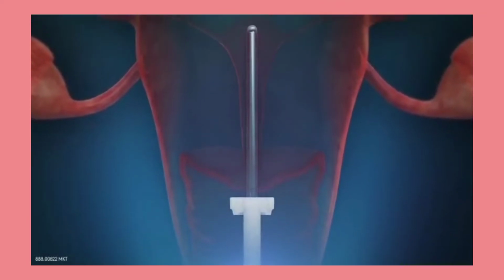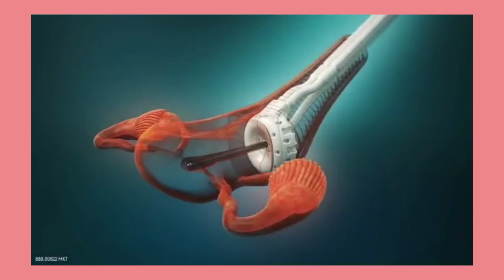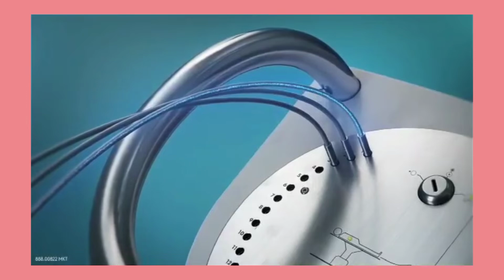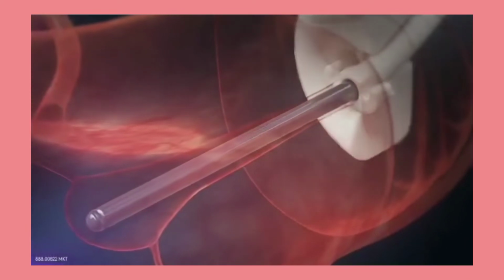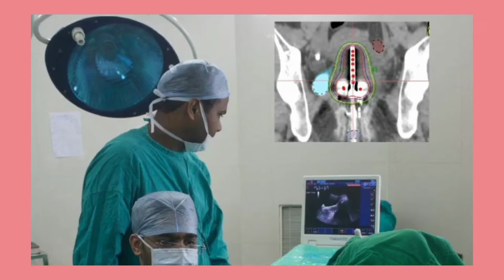For certain HDR brachytherapy treatments, catheters, tubes, or wires that transport the radiation source can be inserted through needles. Treatments take only a few minutes, and then the radioactive source is removed from your body. Applicators may be left in place until you've completed all treatments, or they may be removed after each treatment. Radioactive material will be inserted into the brachytherapy applicators with the help of a computerized system. Your radiation therapy team will leave the room during your brachytherapy session but will observe you from nearby. Most people undergoing this therapy feel no pain during the procedure.